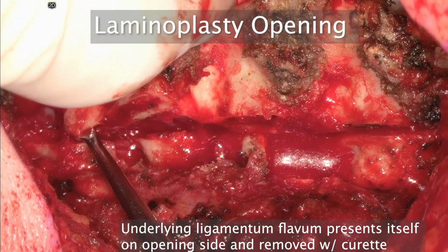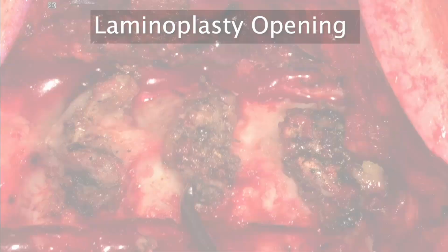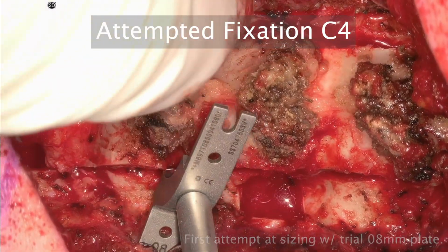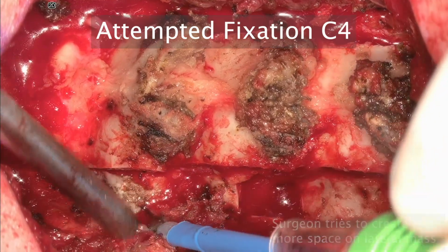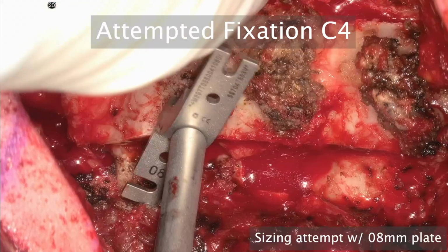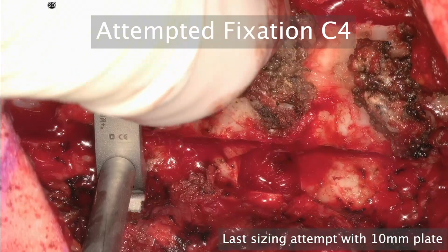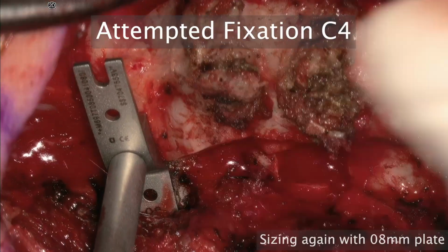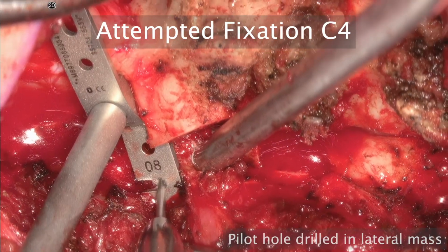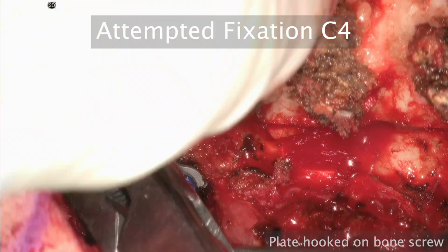When we were editing this, I made sure that you would include this because one of the more difficult things is the instrumentation, which is a bit counterintuitive because the instrumentation really does not provide much biomechanical strength. It really only is designed to hold open the lamina. What you can see here is that you can get an excellent decompression, but we also depend on these small titanium mini plates to hold open this area.